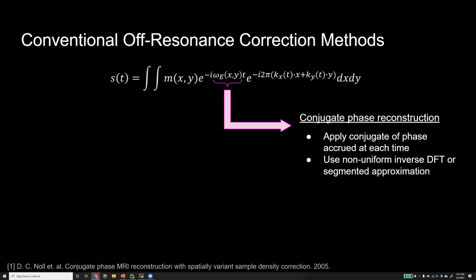the off resonance. Some limitations for that are you basically need accurate field maps, and that could be hard to acquire because field maps can be noisy and may not be exactly accurate. You also need to perform 2 separate scans to acquire field maps. And this method can be computationally slow because you don't use FFT.